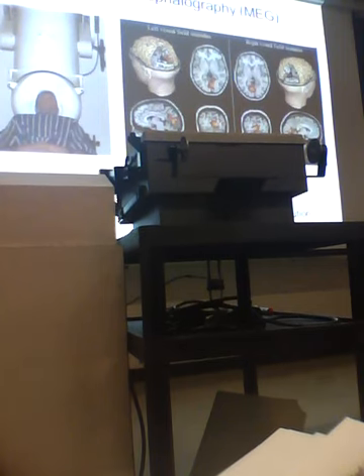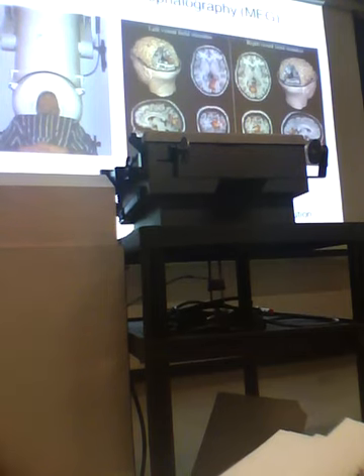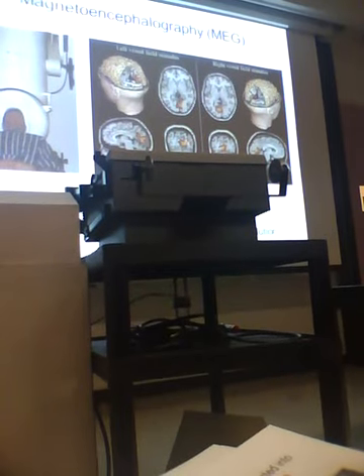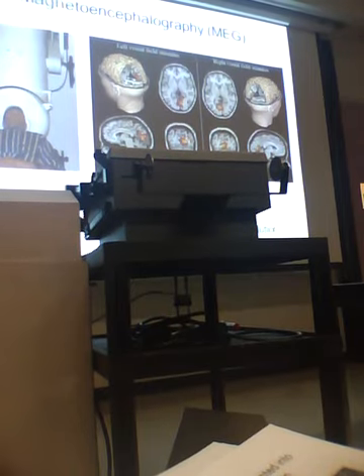Magnetoencephalography. This is just a research tool. There is not a machine like this in Edmonton. The closest one is at UBC in Vancouver. When cells become active, they generate electric fields, and with every electric field there's an associated magnetic field. That's just a basic law of physics. So you can either record the electric field, which we do with electrical devices, or you can record the magnetic field. But recording magnetic fields is very difficult and expensive. Nevertheless, it can be done.